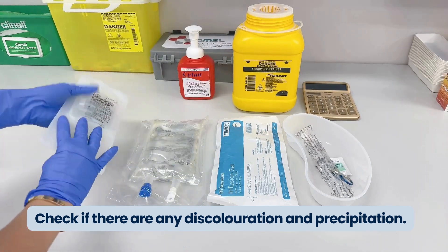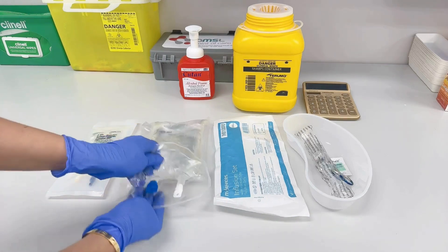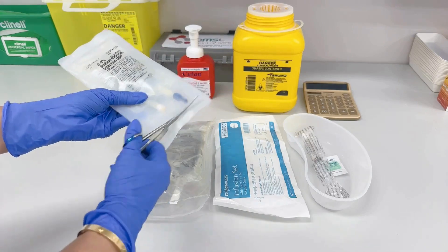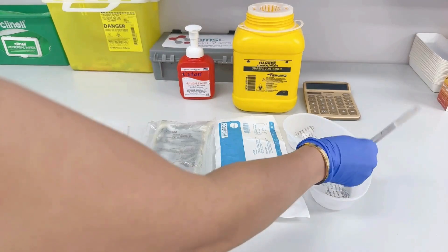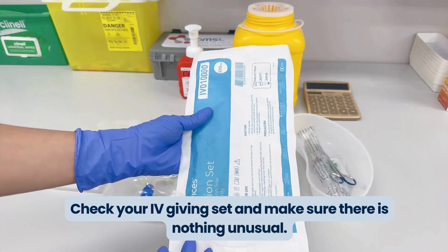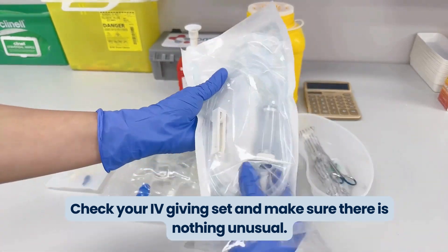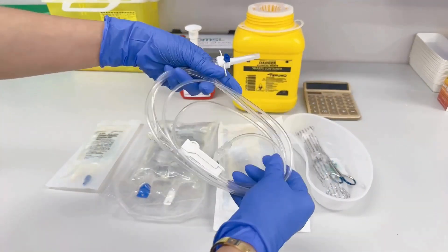There are easy open-access IV fluid bags. However, if it can be challenging to open, just make sure you use your scissors to open them. Now check your IV giving set, making sure that there's nothing unusual on it. As soon as you open it, check the tubing for any abnormalities.